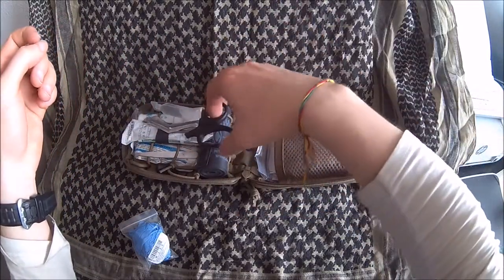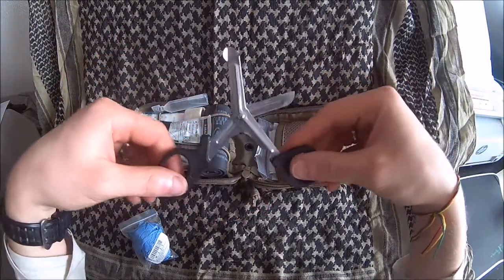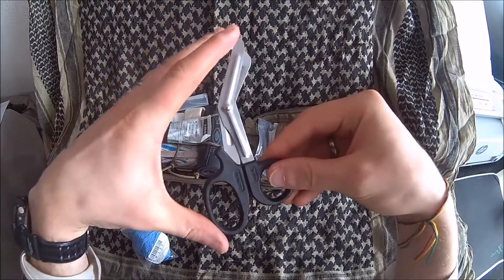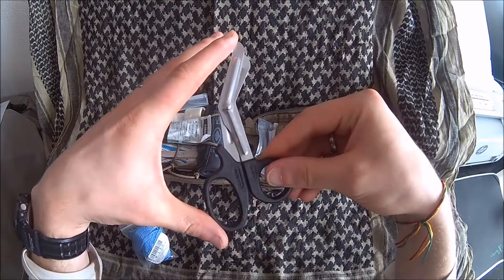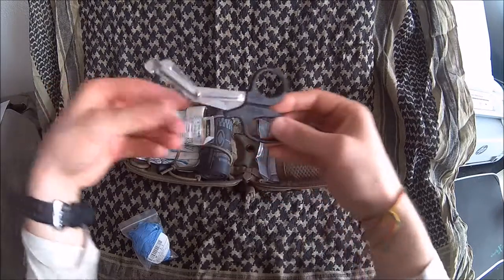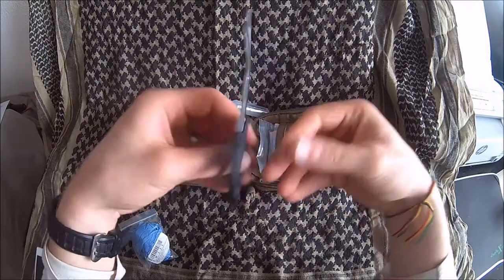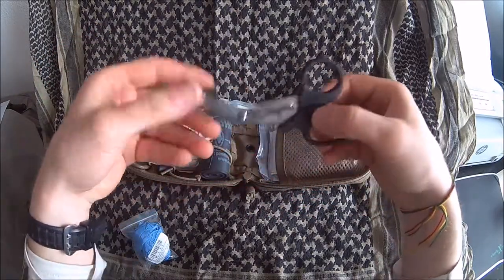Second, and also very easy to reach, are some EMT shears. This is the short version — 14.5 centimeters overall length if I remember correctly — so very compact and they fit snugly into this case. I tried them out and they are very capable; you can cut through jeans material and stuff very, very easily. You should always have a good pair of shears.